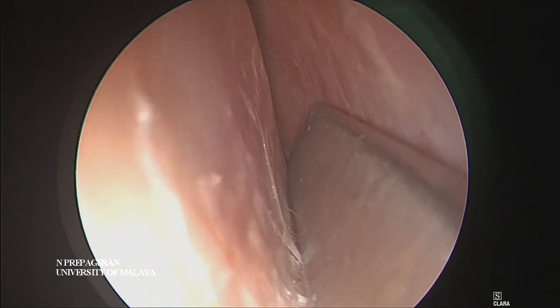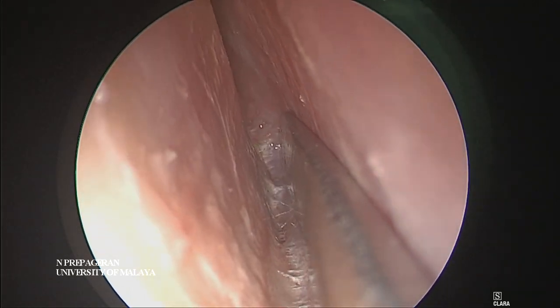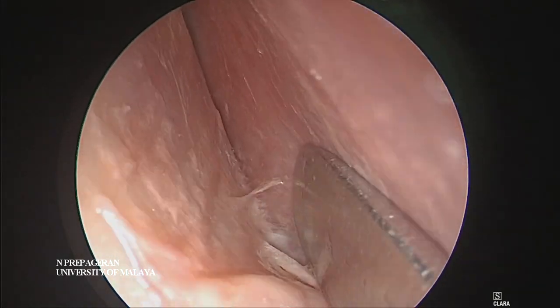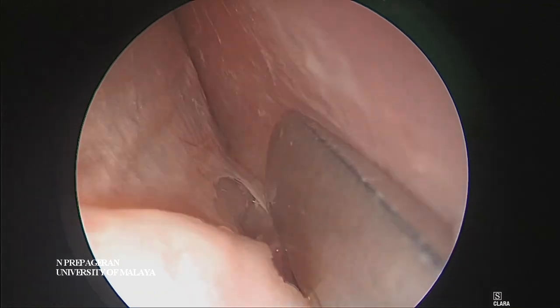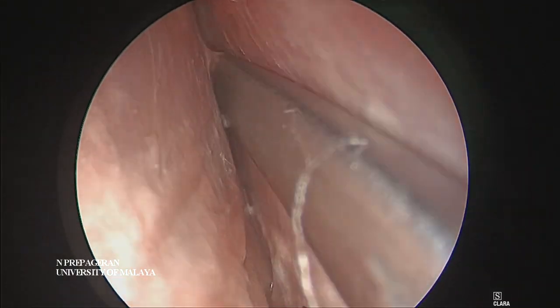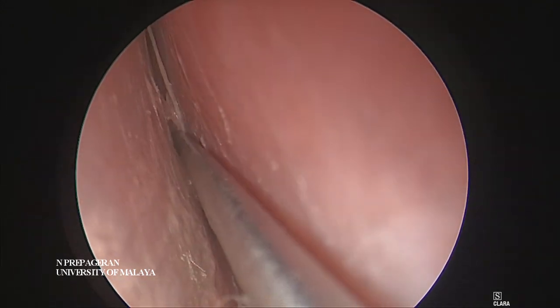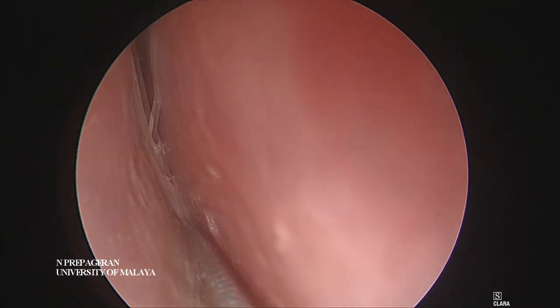Here we're coming to the inferior tunnel. We know there's a septal spur - a very prominent spur there. The spur makes it very easy to tear the flap accidentally. Can you see that? There's the spur and this is the mucopericondrium. We want to go all the way up to the keel.